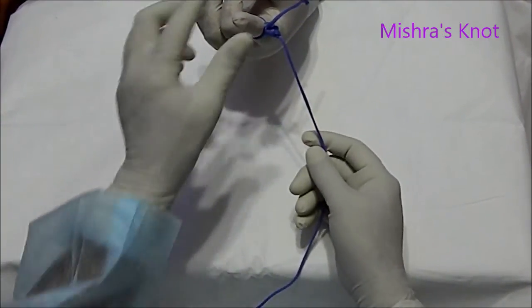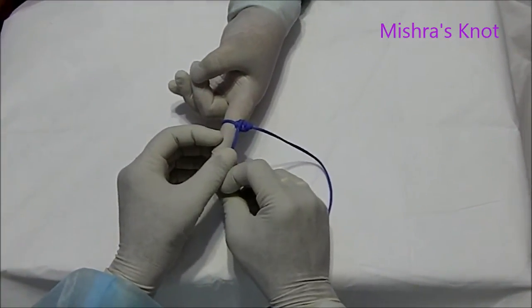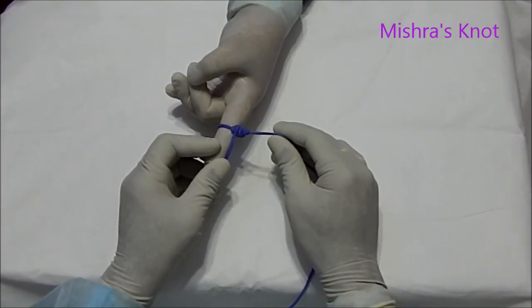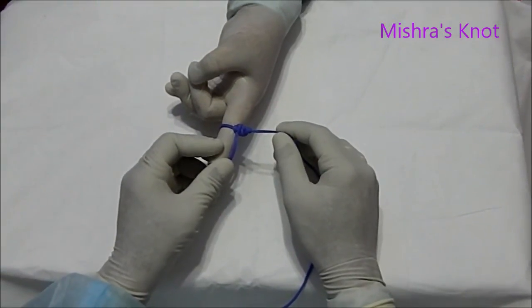This knot is comparatively very secure. It is more secure than the Melzer and Roeder knot.